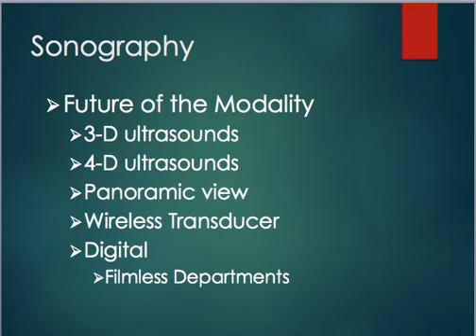The future of the modality, they have listed 3D ultrasound. 3D ultrasound's already here. 4D ultrasound, HD ultrasound, panoramic views are new, and then also wireless transducers. So wireless transducers obviously don't have the wire that's going to connect to the machine. So the nice thing about that is it gives you a little bit more range. The downfall to them is they get lost. You set them down next to the patient, forget about them. They also need to be charged, so it runs the risk of the battery dying and things like that. And then also digital is not the future, it is here right now.